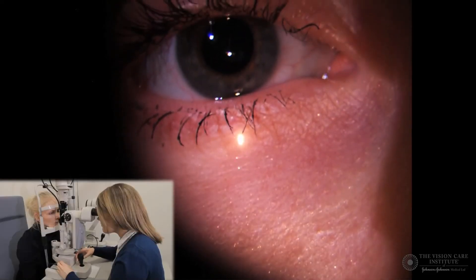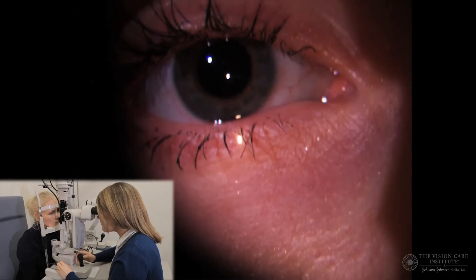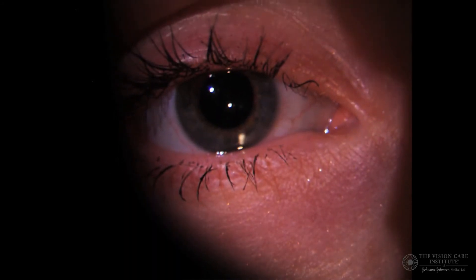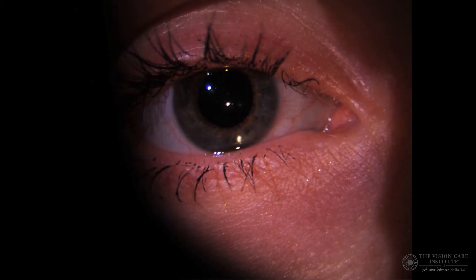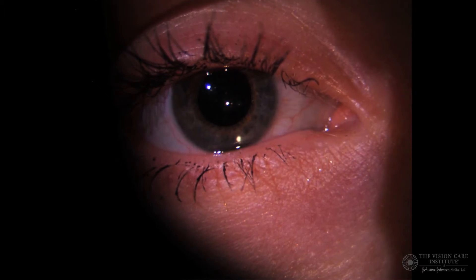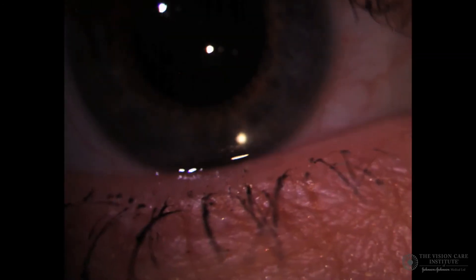Once this has been formed — and we can do this on the skin as we've seen here — we raise the whole slit lamp upwards and onto the cornea. If the observation and illumination system are lined up, we will see just one circular patch as we have here.